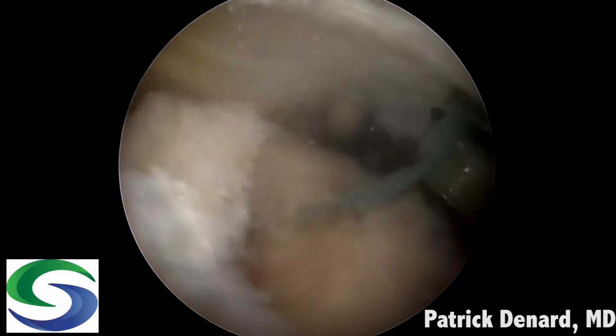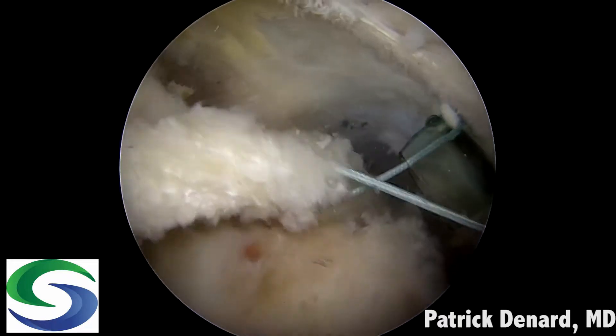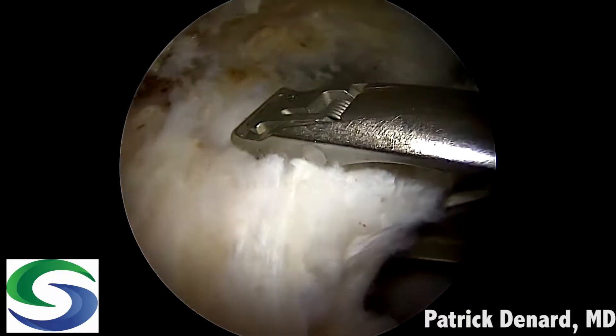We've already performed a biceps tenodesis anteriorly and repaired the subscapularis tendon. We take those sutures from the biceps tenodesis and tie those down anteriorly to reinforce the rotator cable, and now we're going to move to our ripstop.